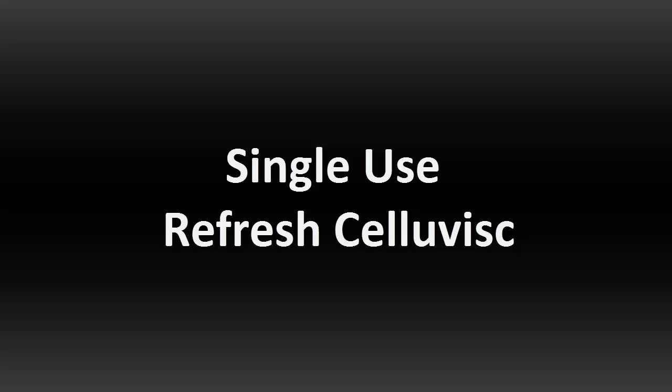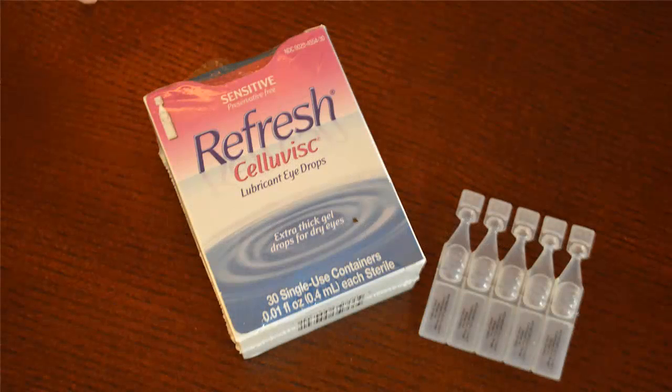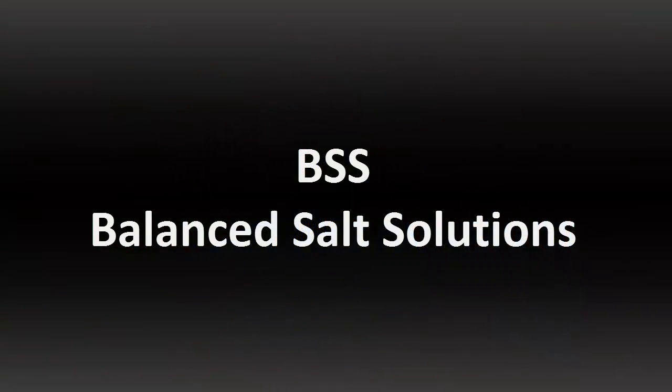Single-use Refresh Celluvisc. Again, no preservative and no buffers. Single-use vials also reduce the risk of contamination. This method has other advantages though. Because of its thick properties, some practitioners are using it to manage ocular surface disease such as dryness. But it can also help with issues surrounding bubbles or spillage during insertion.